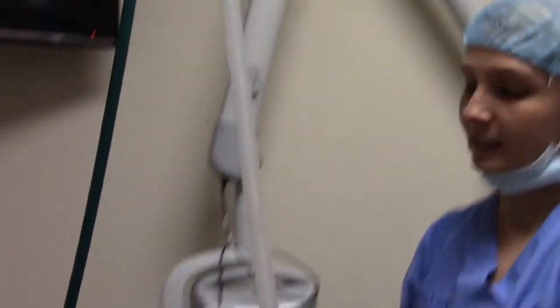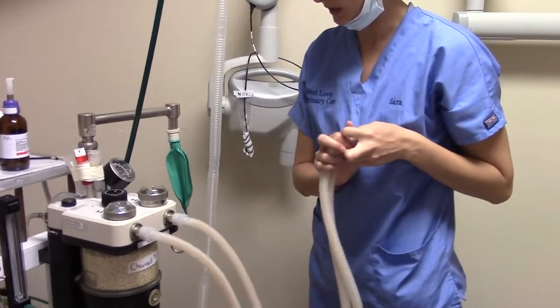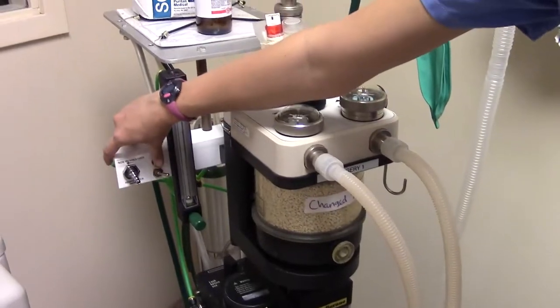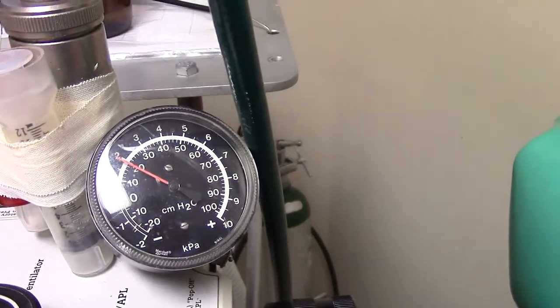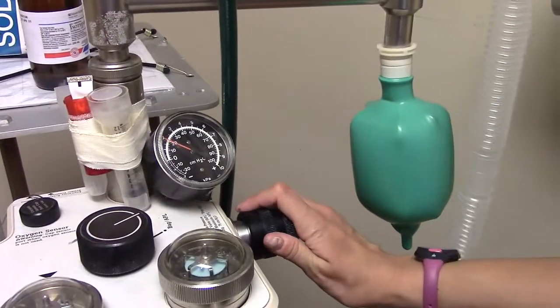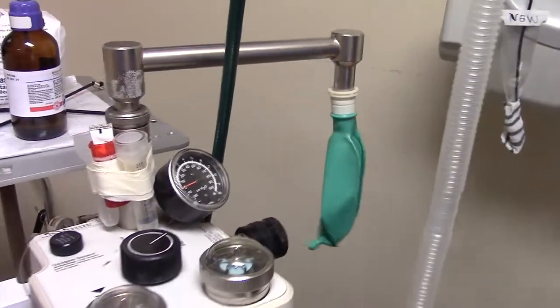We're going to do a low pressure test right now to check for any leaks. I'll close the pop-off valve, put my thumb here to block the oxygen, make sure it's on rebreather. I'll blow up the bag so it's over 20 and watch to make sure we're not going down — which we are not. Then to check the pop-off valve is working correctly, I'll open that, and it's gone down to zero, so that's working correctly.